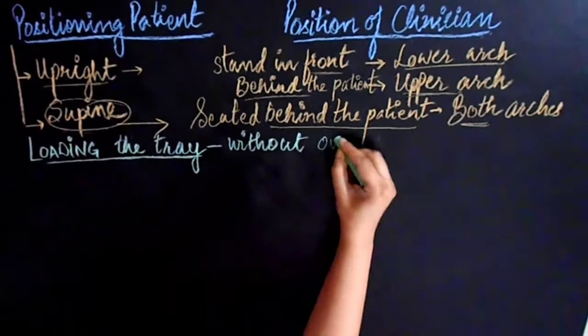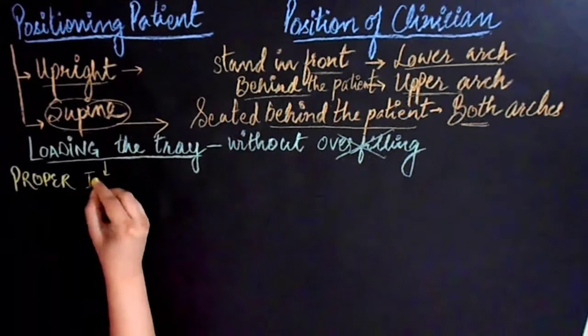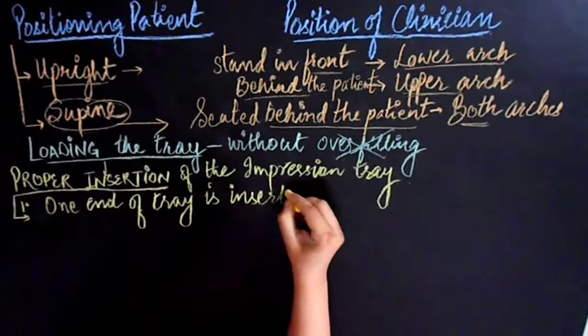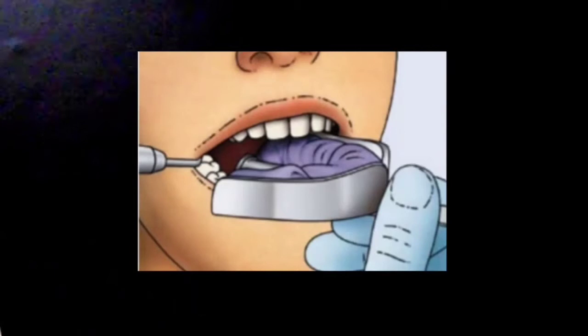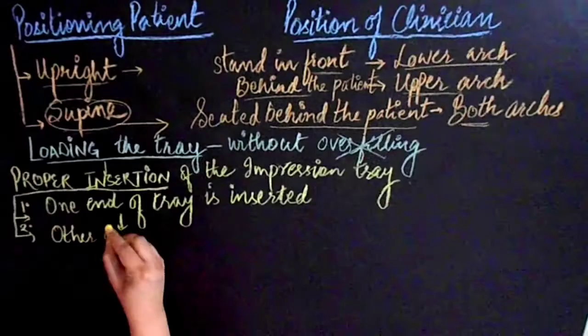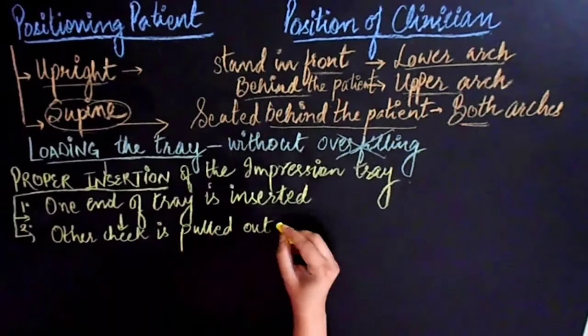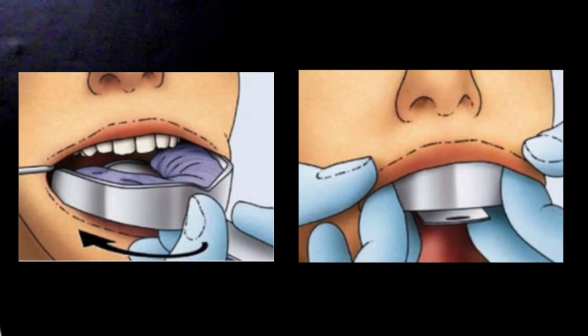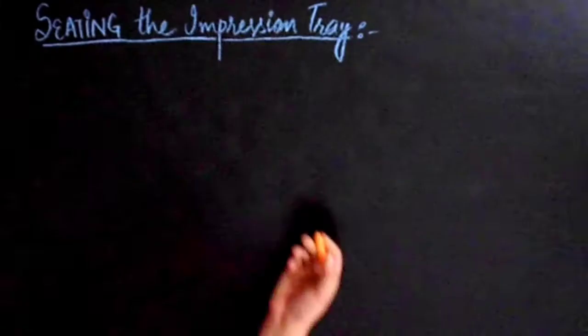After loading the tray correctly without overfilling it, the next thing is proper insertion of the impression tray. When inserting the filled tray into patient's mouth, at first one end of the tray is inserted, then the other cheek is pulled out of the way using the tray itself. The tray is completely inserted and positioned with a rotating movement.